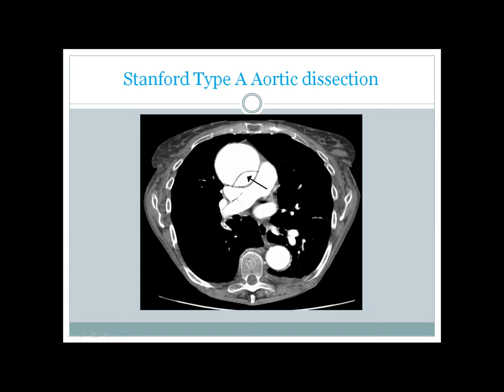Here you can see the great vessels, especially this big one which is the ascending aorta. In this ascending aorta you can see a false lumen forming, and here you can see the flap of aortic intima that is torn off from the main wall and going inside the vessel wall. So here a false lumen is being formed inside the wall of the aorta.